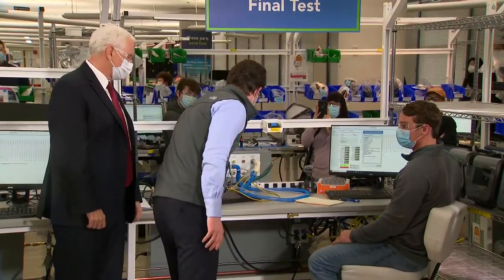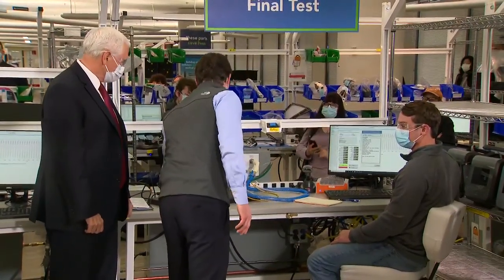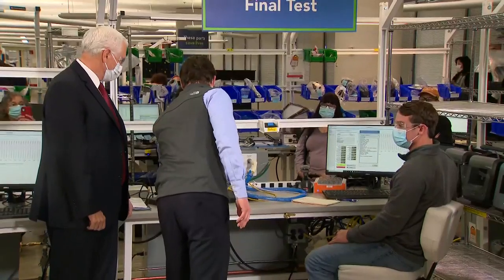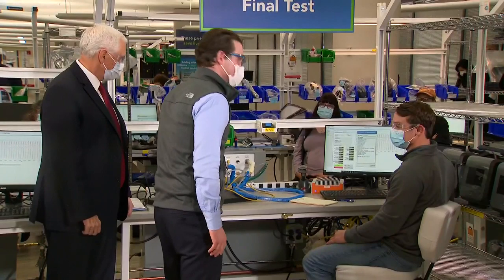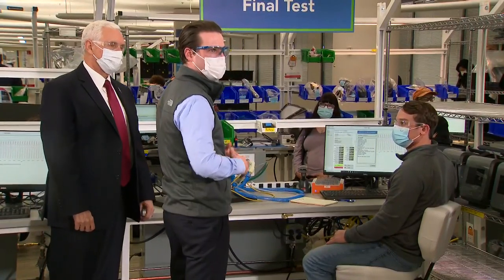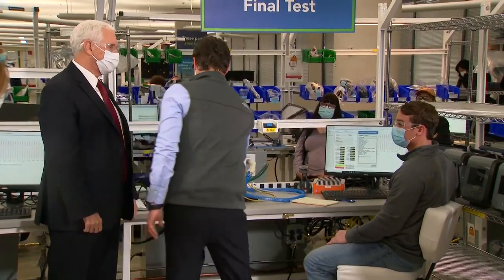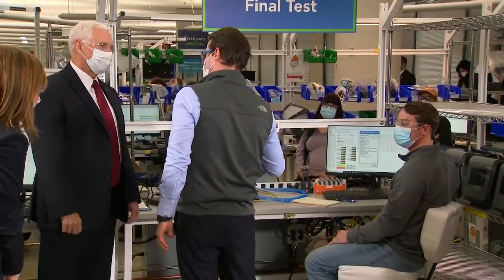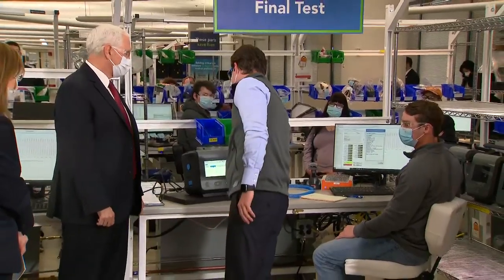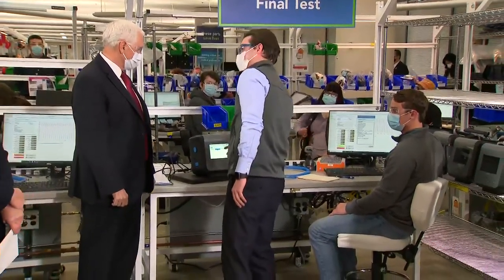So everything here, you've got your status bar, it's going to show you your batteries. The battery's really easy to pop in and out. Battery power is critical when you're thinking about field support. This is the most common monitor that you're going to see. This is what you're going to see when you first walk into the patient's room. When you go here to the therapy screen, this is where you actually control what's happening on the ventilator. You can see your external oxygen, your external nebulizer, that's your medication.